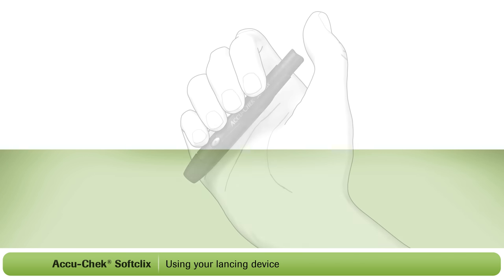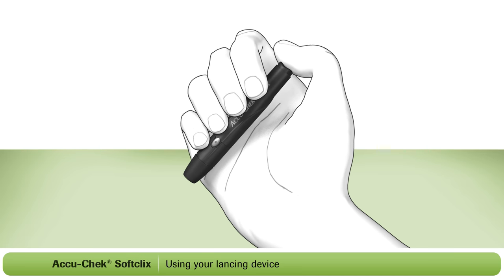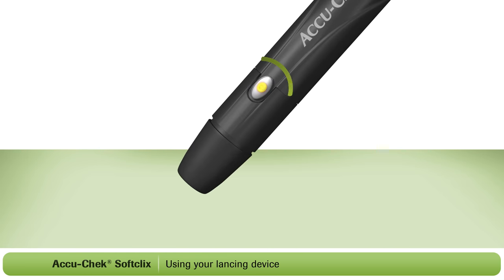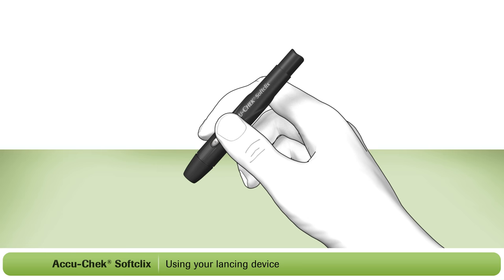To use the lancing device, you first need to prime it. Press the plunger all the way down. The release button on the side of the lancing device has now turned yellow. This indicates that your lancing device is now primed and ready to use. Press the yellow button to release the lancet. This will lance your finger.